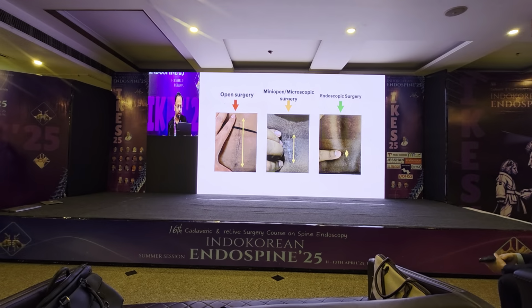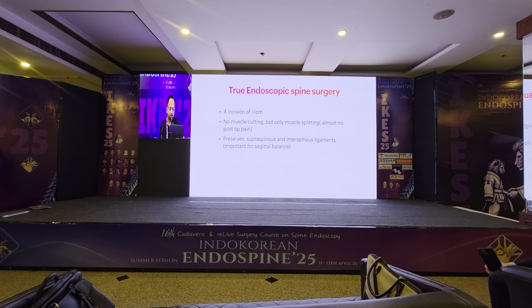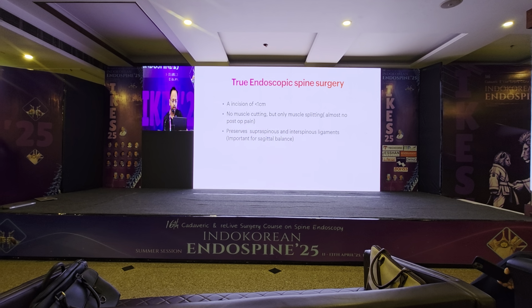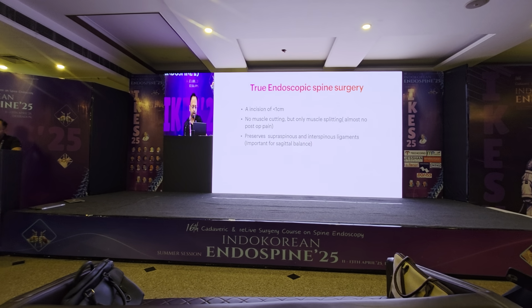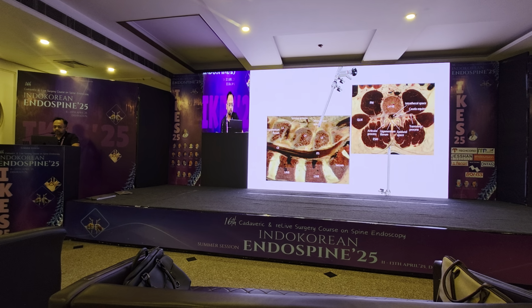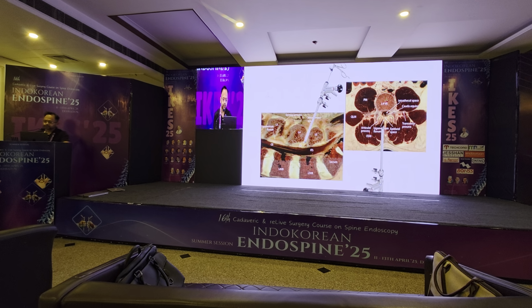So what is true endoscopic surgery? An incision of less than 1 centimeter, no muscle cutting but only muscle splitting, so almost no post-operative pain. It preserves supraspinous and interspinous ligaments, which are important for sagittal balance. So you just feel the cranial lamina and go down and go into the interlaminar window, which is interlaminar surgery.